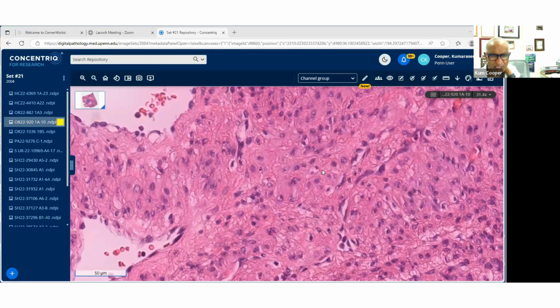Let's see, malignant schwannoma. So schwannoma and malignant schwannoma was put through on the chat. The S100 was negative, but MPNSTs, as you know, may be very patchy, if at all, focal S100, if at all. There's another: leiomyoma, schwannoma, SFT have been described in the uterus.